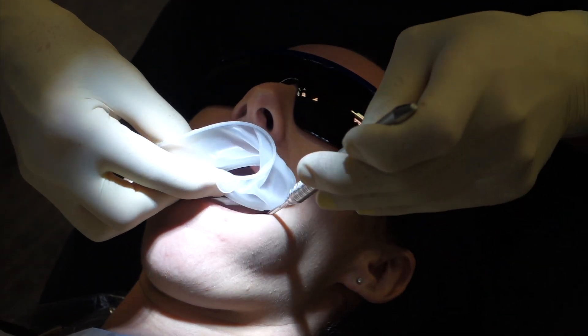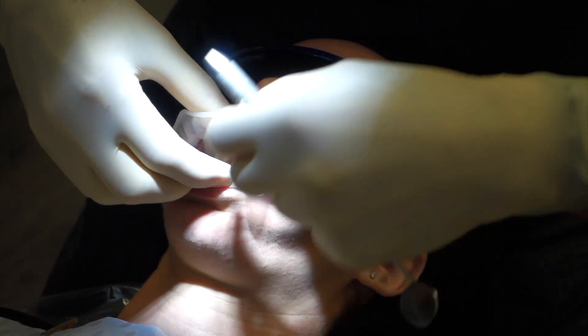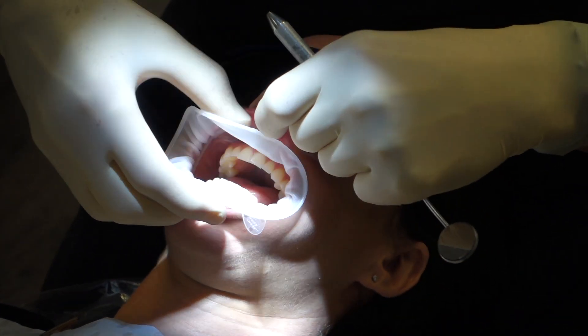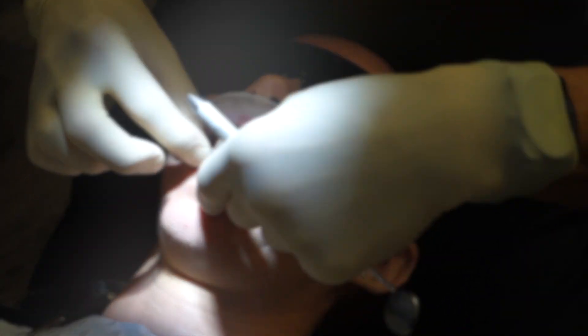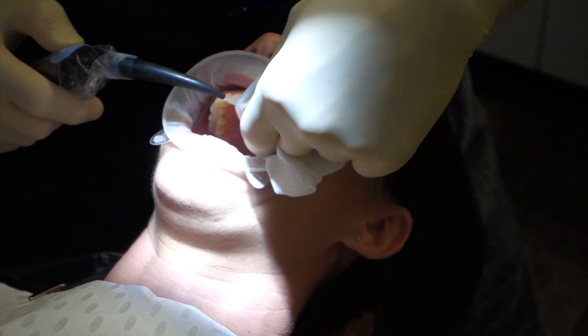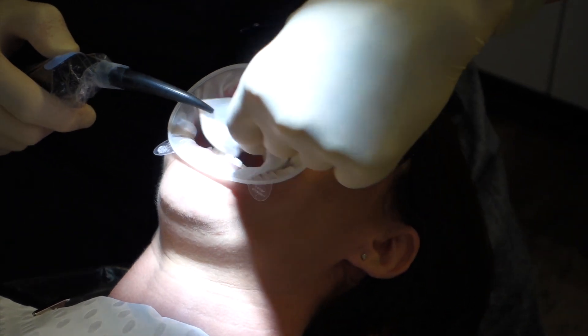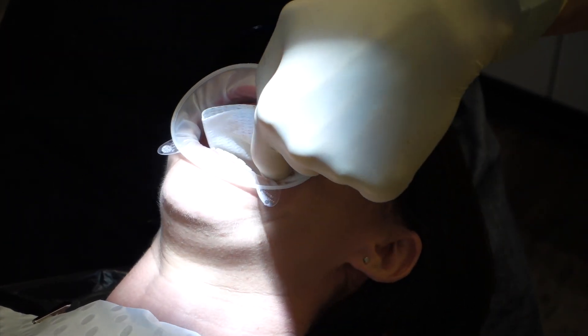We can see that I'm inserting an OptraGate, which in itself can be quite tricky to keep the teeth isolated. Drying the teeth is an important part of attaining an accurate scan, as moisture can and will alter the accuracy of the digital scan.